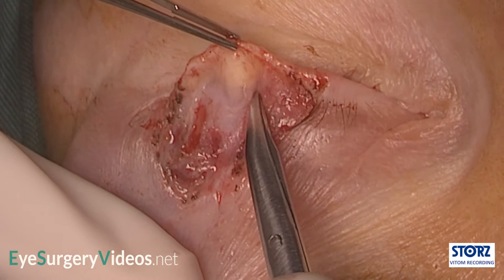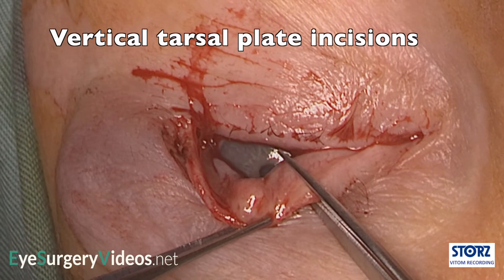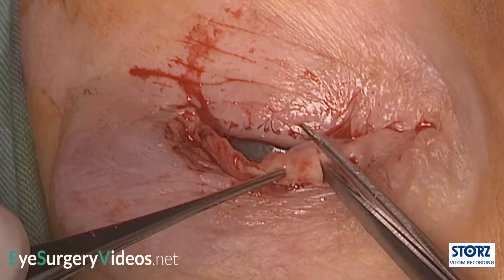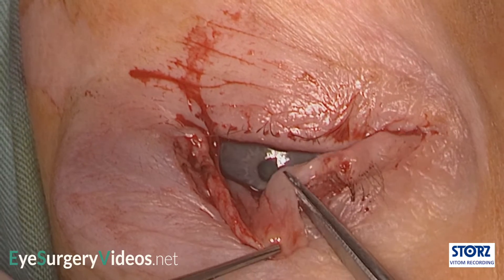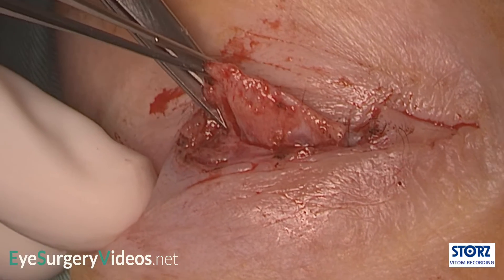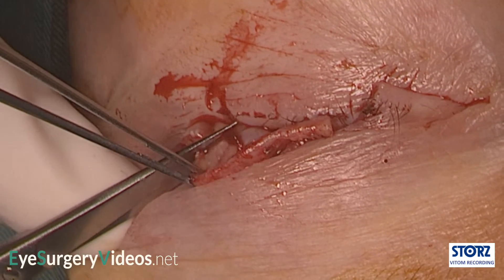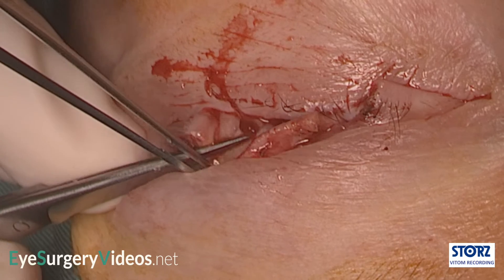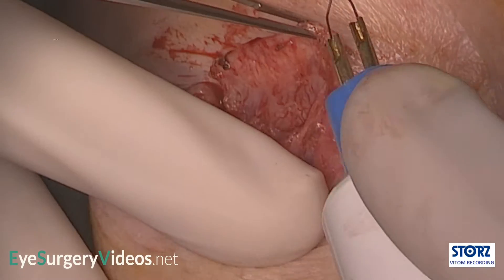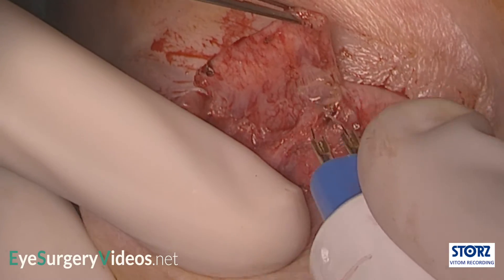The emerged septal retractor fibres are dissected off the tarsal plate. The edges of the defect are continued as vertical incisions into the residual superior tarsal plate.